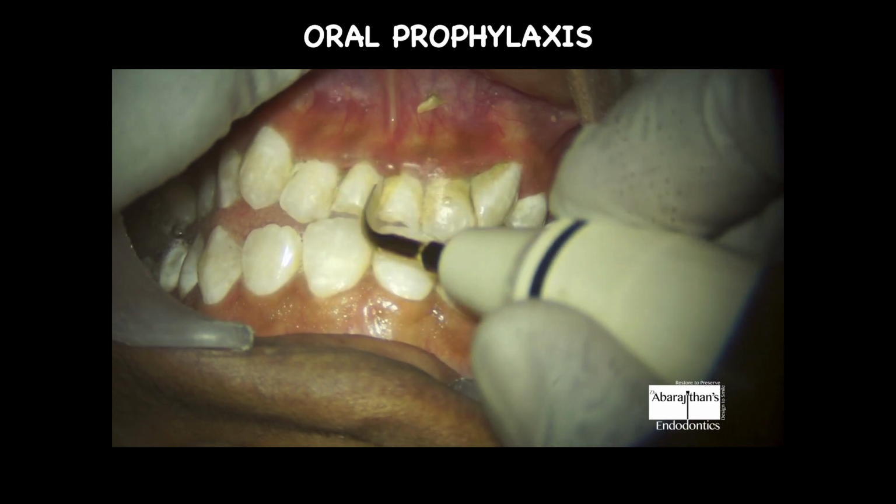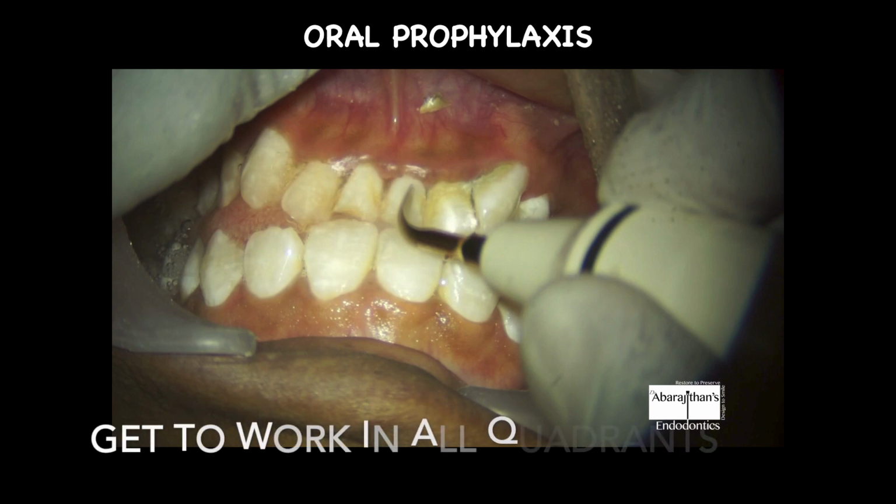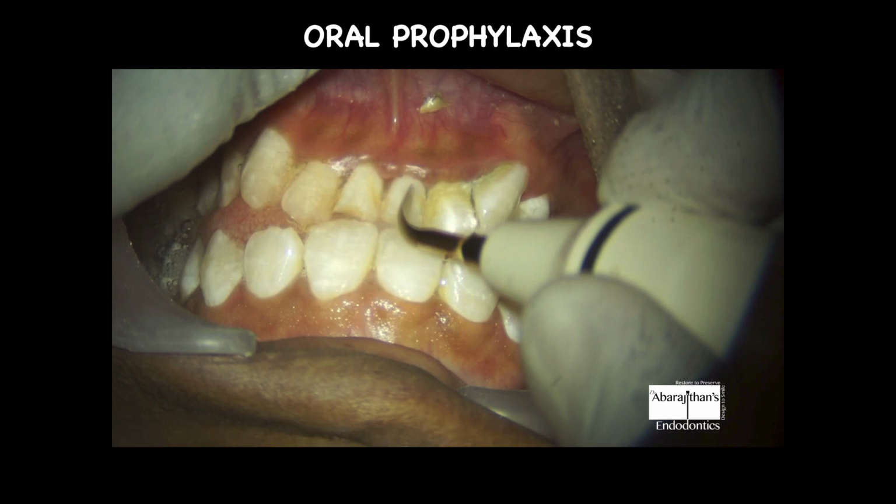From a 12 o'clock position behind the patient, using magnification, do at least 5 to 10 oral prophylaxis on patients. Why I'm telling you this is when you use a rotary high speed instrument with this new ergonomic posture, you may tend to do some errors in the beginning, and when you use a scaler, the chances of doing these errors are very less. And so this is one of the exercises that I recommend for people who want to master this hand-eye coordination at this highest level of ergonomics.